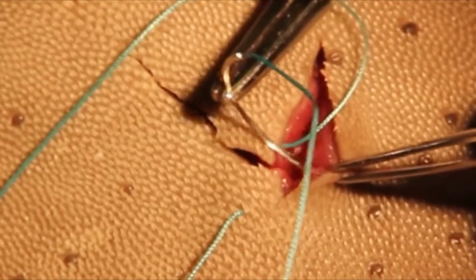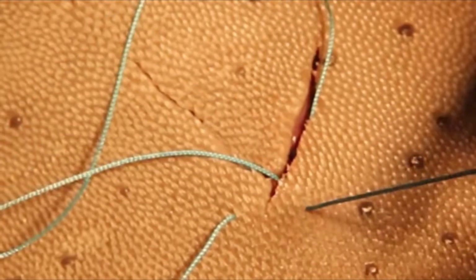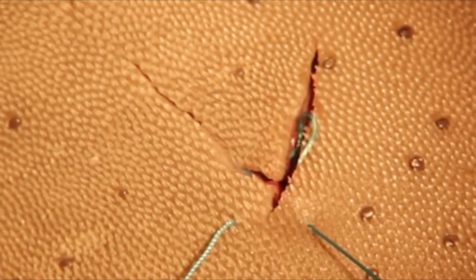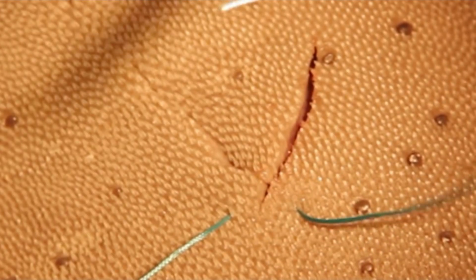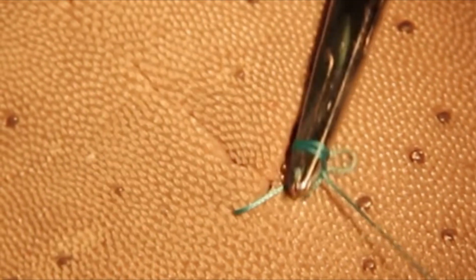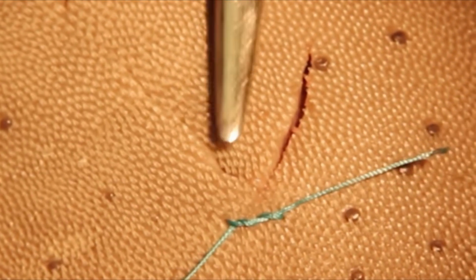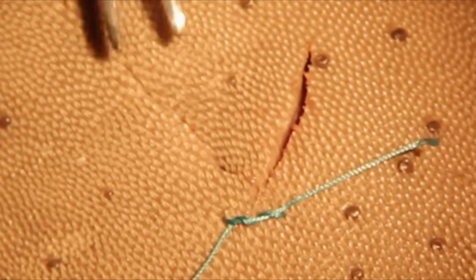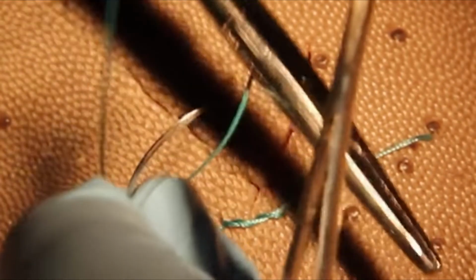Then move to the opposite wound edge and take the matching bite, again coming from the subcuticular plane back out to skin. The pattern is designed so tension is distributed under the corner rather than concentrated at the apex. Now tie the stitch. Pull smoothly and in line with the wound so the corner settles into place. The goal is just enough tension to seat the tip, not enough to blanch it. Make sure the wound edges are all in the same plane and avoid any inverted edges.